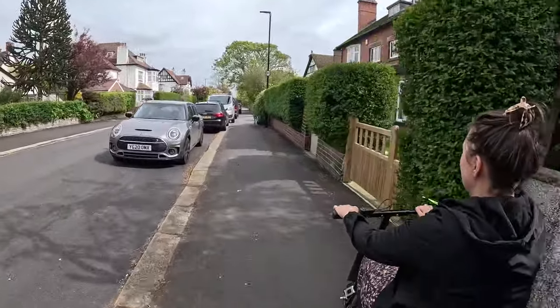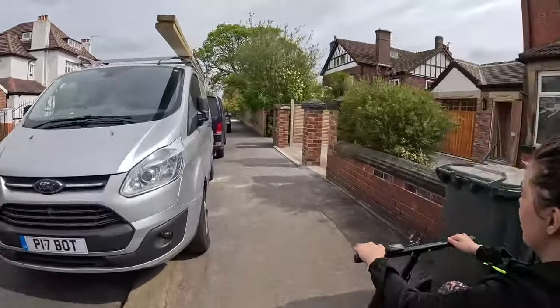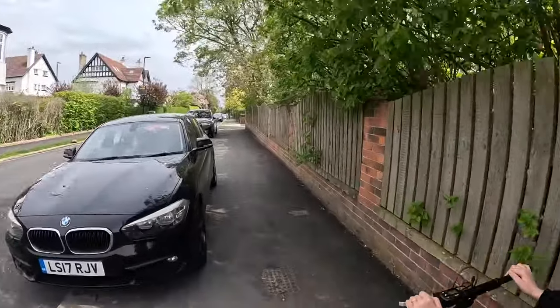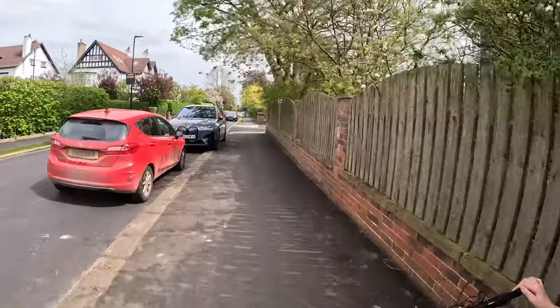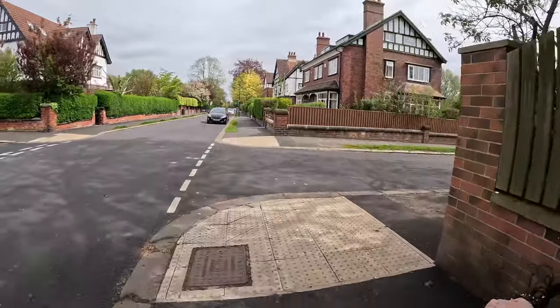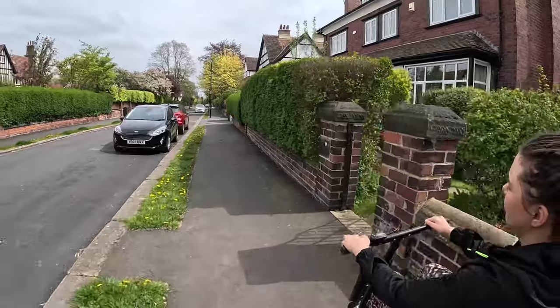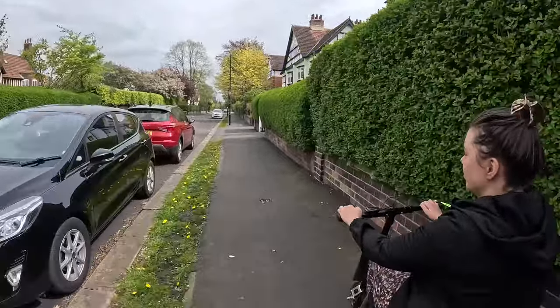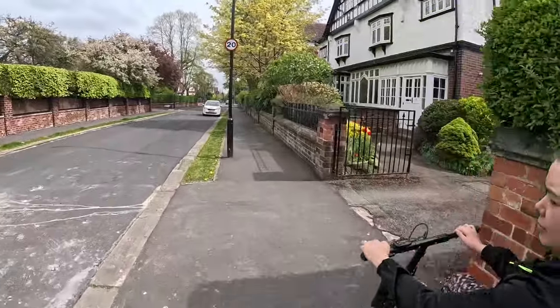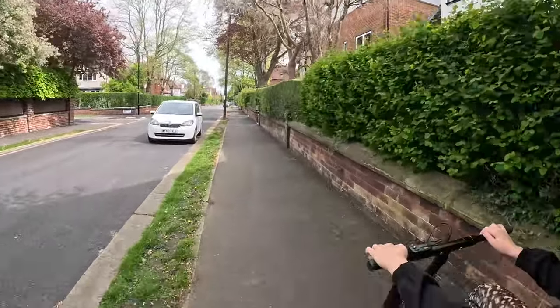From an inconvenient point of view though, the thumb throttle I have — which is the 2022 model — doesn't maintain speed, so you do have to constantly press and hold it. That's absolutely fine, but I think the new model now does have a constant speed feature, so if you're just walking with someone you can have it on like cruise control.